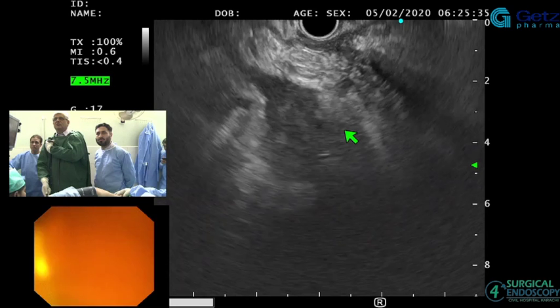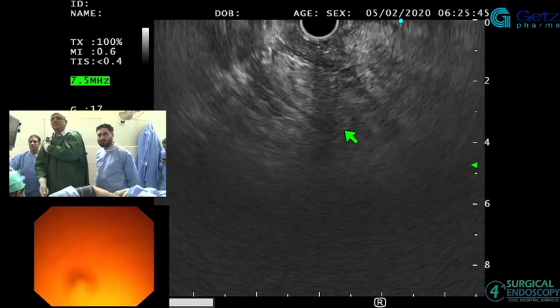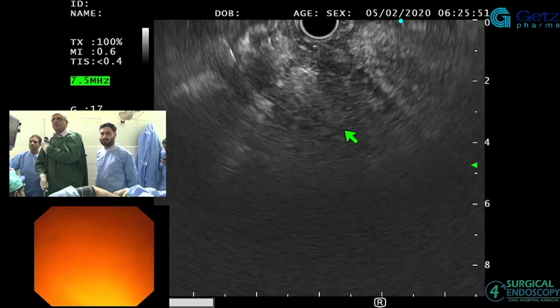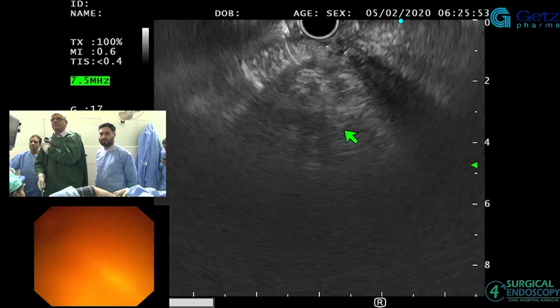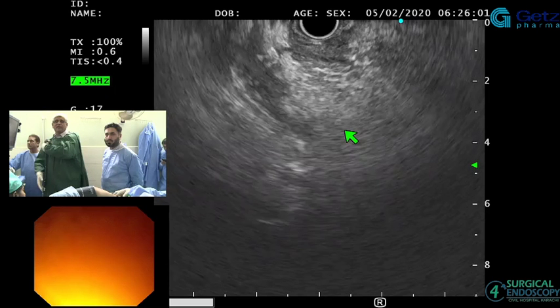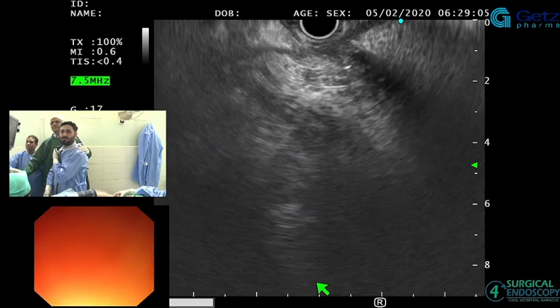So we've got the stent, so I let go of my big wheel a little bit and we can see the stent here, so we'll try and see if we can bring it a little bit more. What I'm doing here is basically just moving slightly, and that's the pancreatic duct. So you've got both ducts, and this is the place where you can quite often see the pancreatic duct going this way when there is pancreas divisum, otherwise it's going there, and both the ducts are going into the ampulla. Okay?